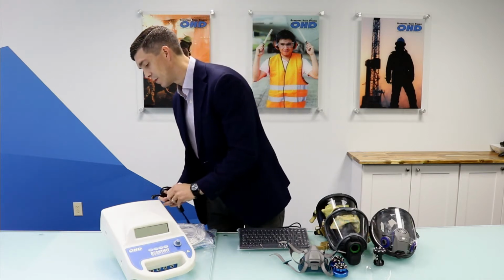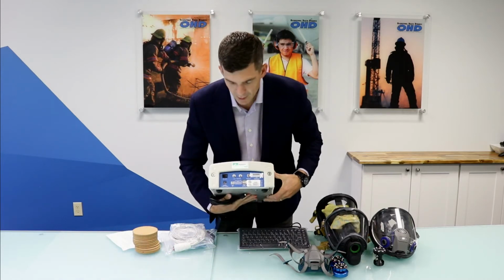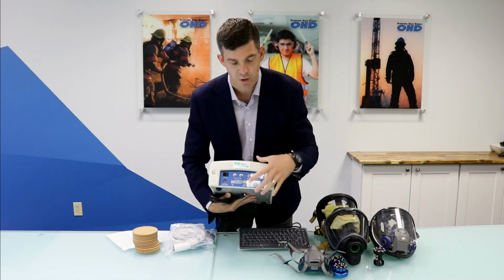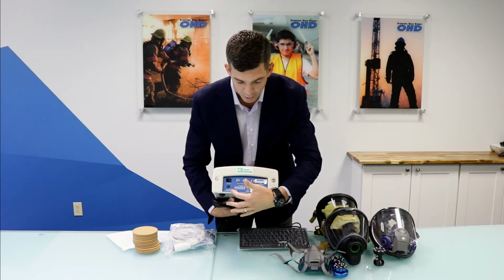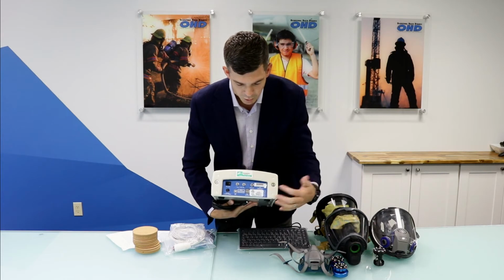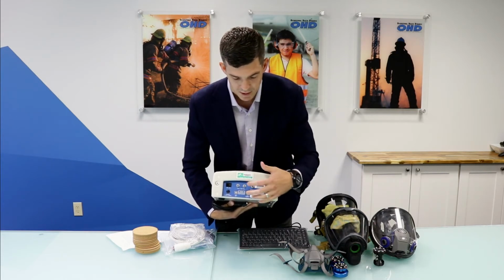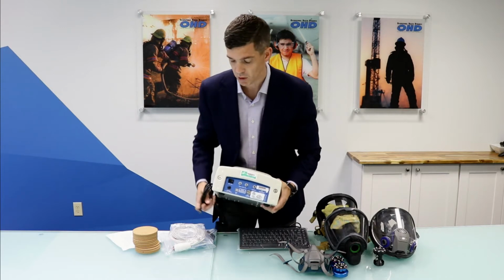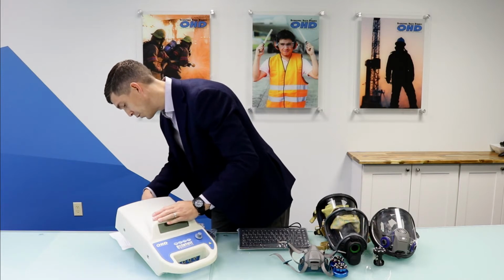So the back of the instrument is going to have a power supply section. And there's more information on this in our Quick Start user guide, some other videos we have. But we have on the back of the instrument power connection. We have our on-off switch, which we'll use, and then our USB to PC connection, which we'll show you in a second, and then our calibration tube. So I'll connect up the back of the instrument, and I'll just push this in.